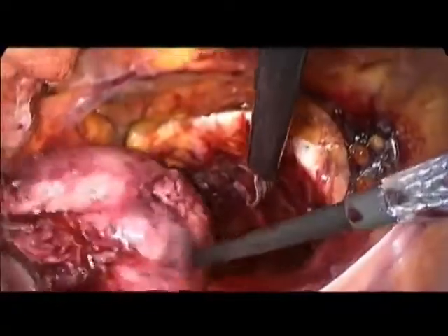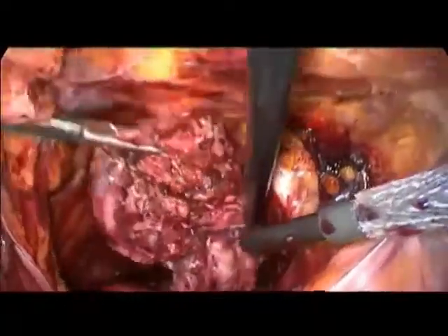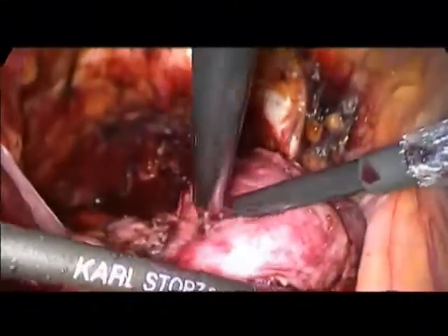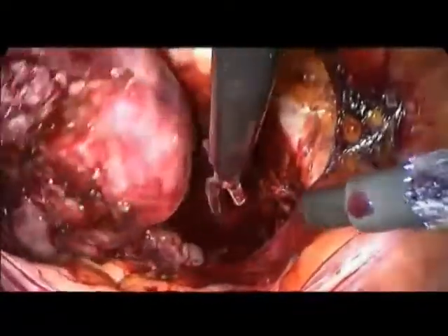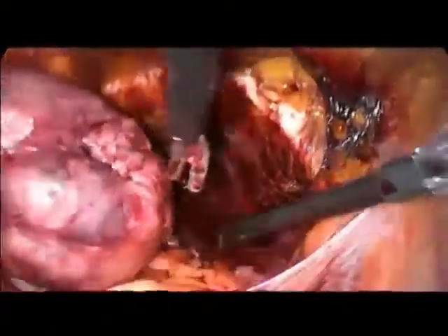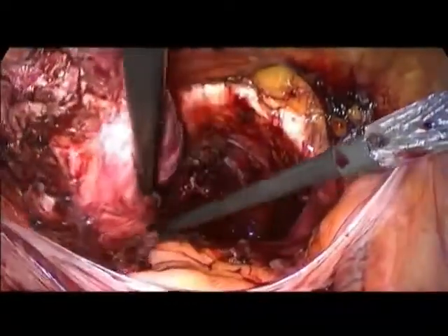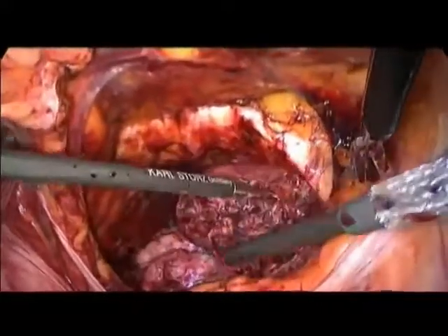And as you can see, we'll see it later on the specimen, except the small error that we were getting aware of at the same time as you were. We have a very nice prostate surface everywhere, with some safety covering also, with regard to the safety of the margins.